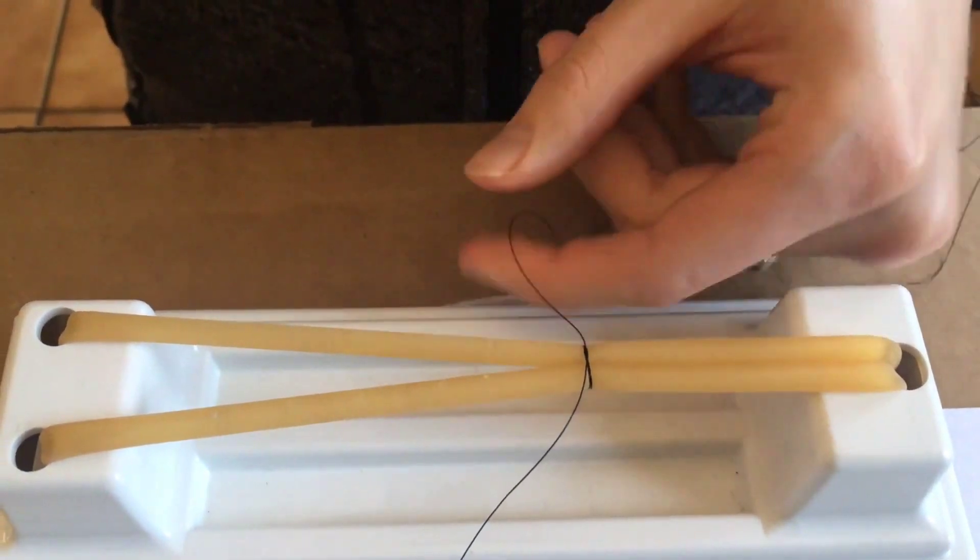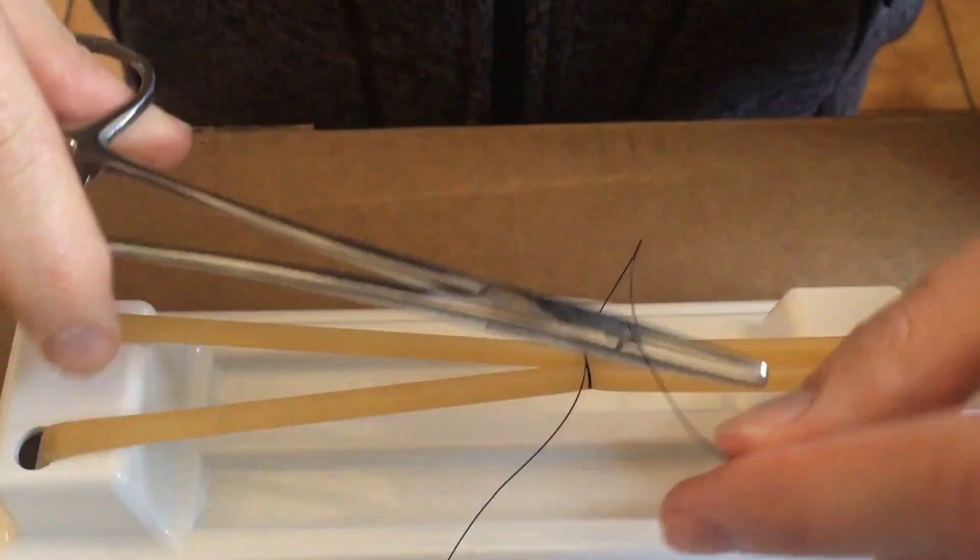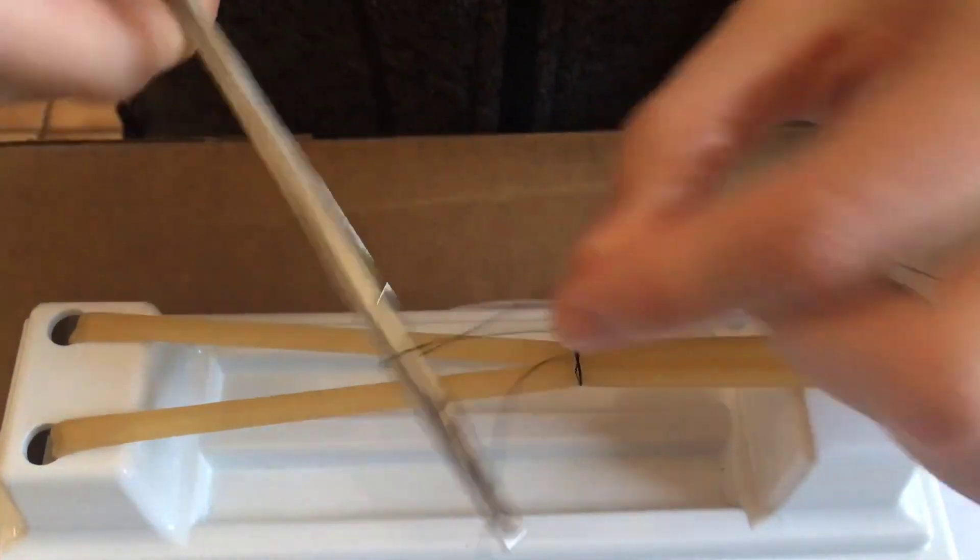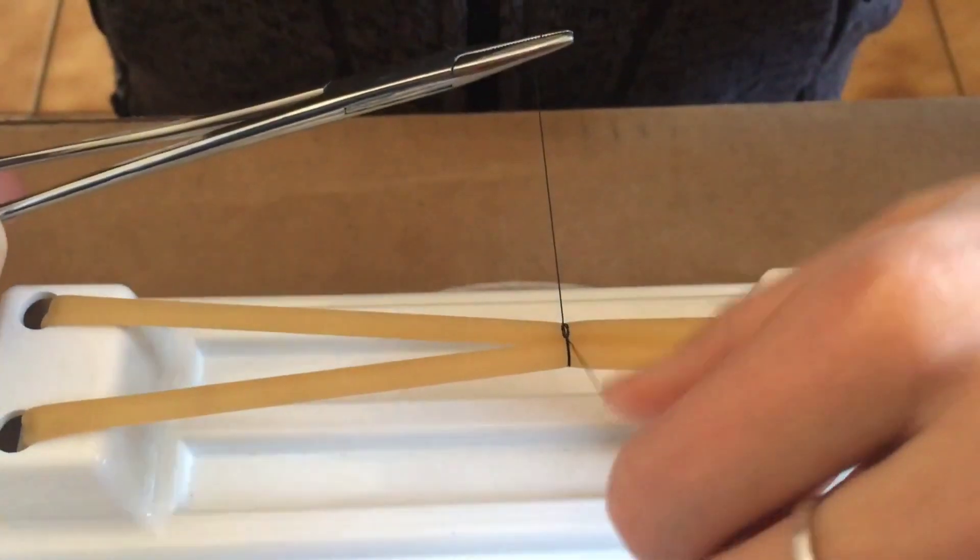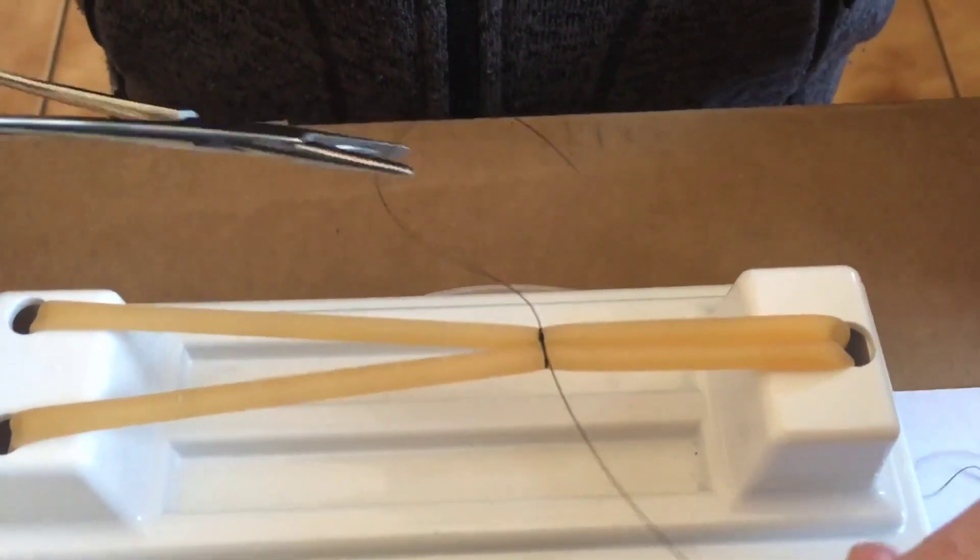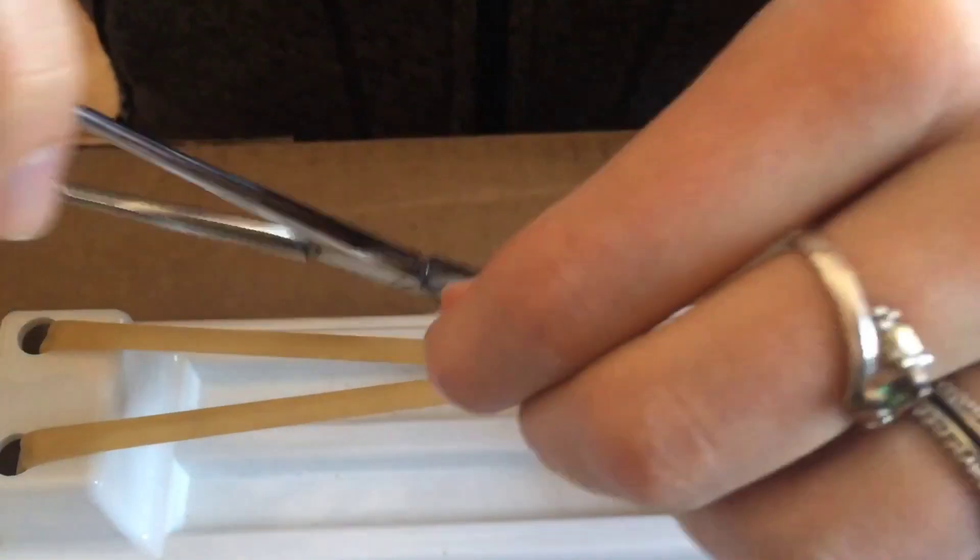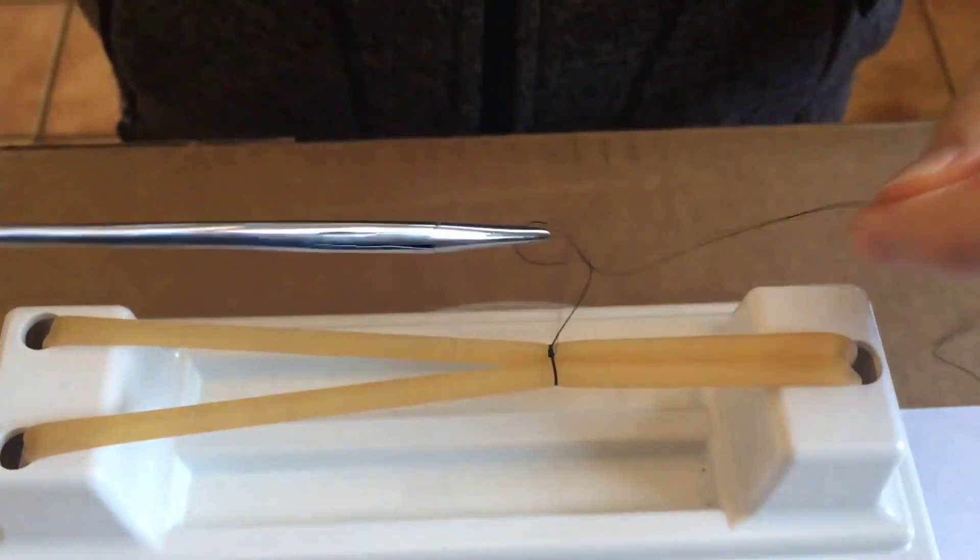From here, it's just like any other pattern we've shown. You want to do six throws to make three knots. That first cinch down counts as one throw. So now I've done two throws, one knot. You just keep going until you're done.